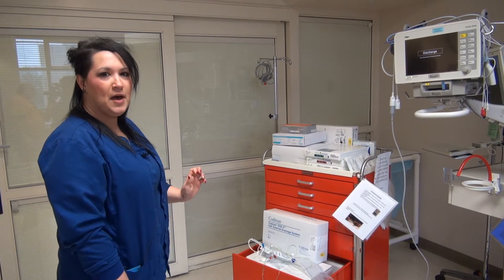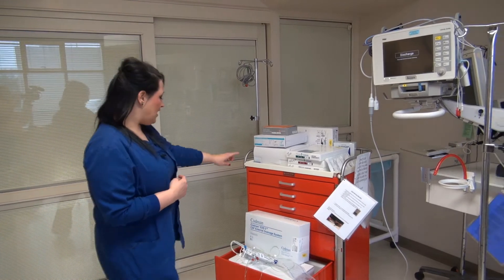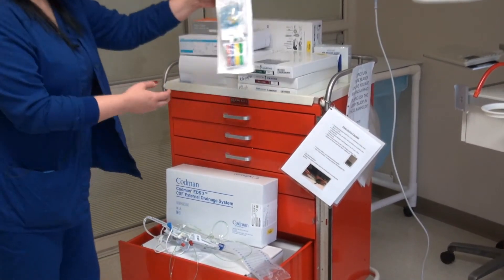We are going to be doing an EVD setup on a patient at bedside. We are going to be using the Codman Drain, and we'll also be needing an art kit.